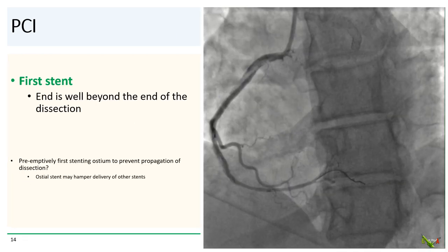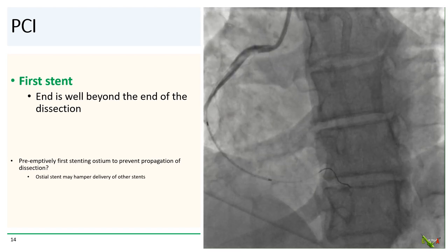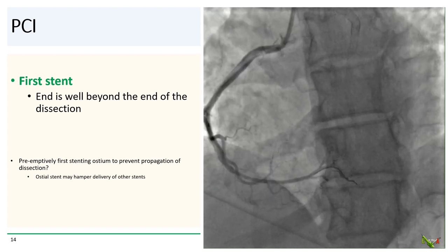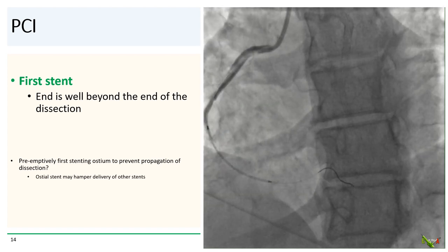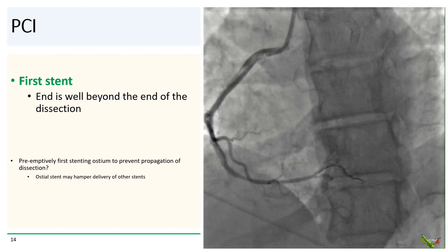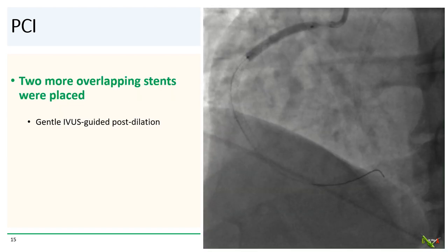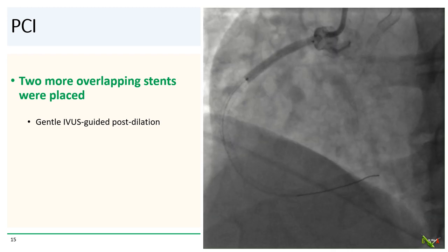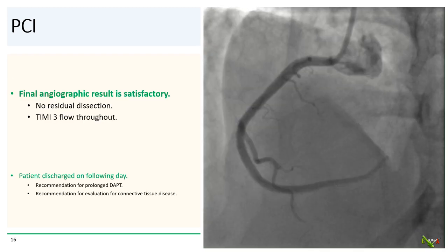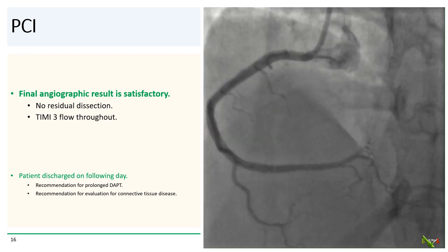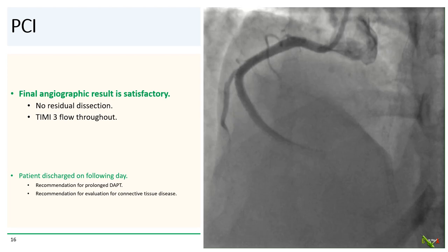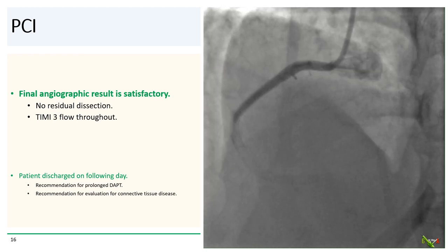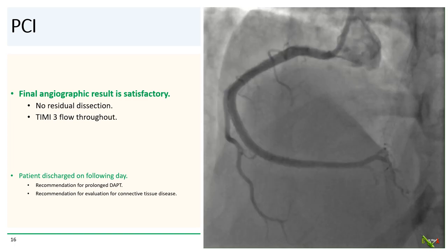Here we are placing our first stent, making sure it's ending in healthy tissue well beyond the end of the dissection. Preemptively stenting the ostium first to prevent back propagation was considered, but in this case hanging an ostial stent out in the aorta may hamper delivery of subsequent stents, so we opted not to do that. Two other stents went in to completely tack up the dissection, followed by gentle IVUS-guided post-dilation. Here's the final angiographic result, which is quite nice — no residual dissection with TIMI-3 flow throughout. The patient went home the next day with prolonged dual antiplatelet therapy recommended, and given her past history of LAD dissection, an evaluation for connective tissue disease was also recommended.